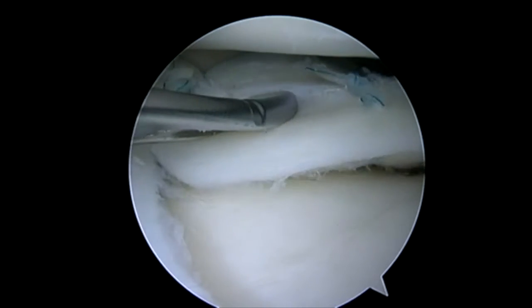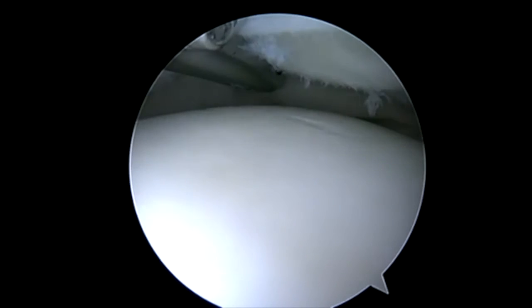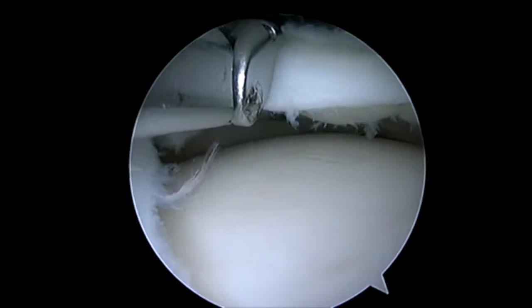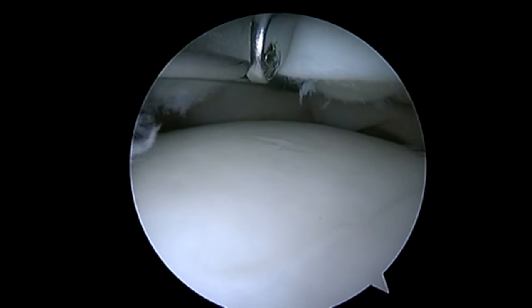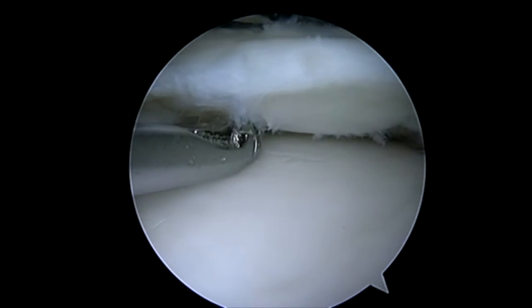So we've passed multiple sutures to repair this rather large meniscus tear. We're going to go ahead and pass again. We extend the lower jaw, again elevating it so that we can get out of the popliteal tendon but staying in the capsule. I pass peripheral first and then I'll pass a more central stitch.